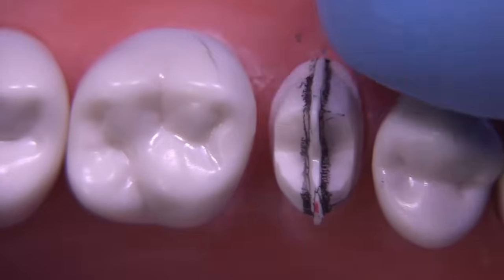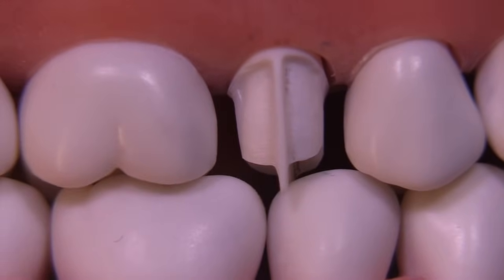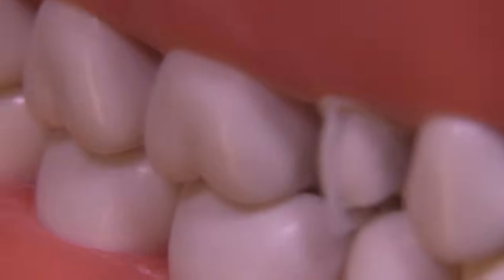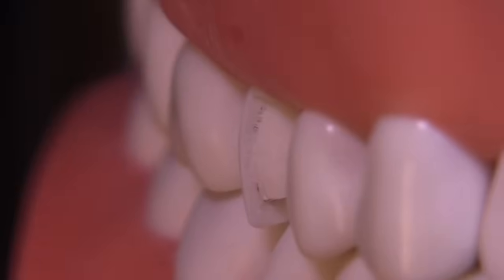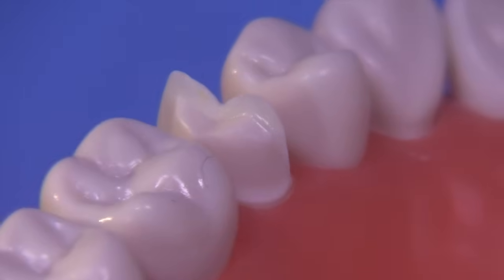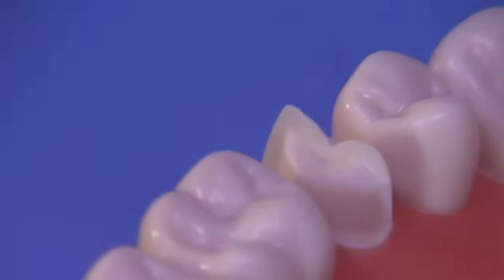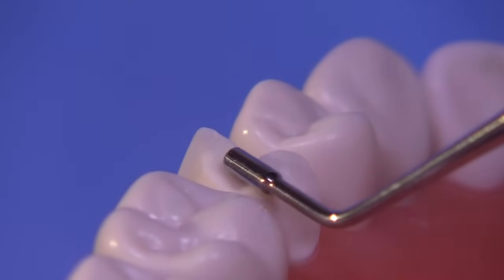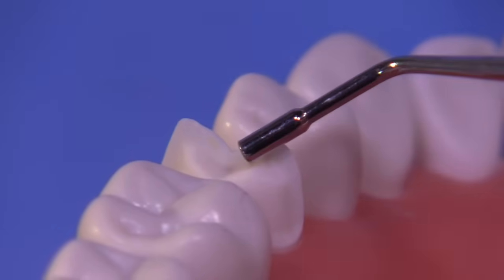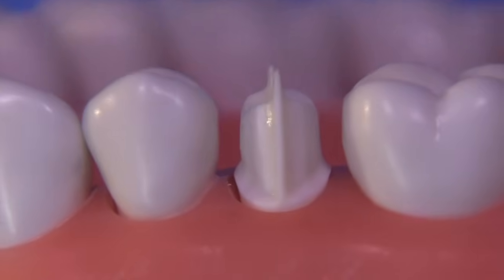Let's go ahead and close the typodont together and see what this looks like in occlusion. At this point, after you've refined the walls and gotten the margins the way you want them, it's a good idea to measure everything carefully once again using the RGS4, which is 1.5 millimeters. You can see I'm more than 1.5 millimeters reduced on the facial in that area, and maybe just a little bit under in some areas — that tells you where to make corrections. The RGS3 is one millimeter; most schools want you to be somewhere between one and 1.2 millimeters of facial shoulder.